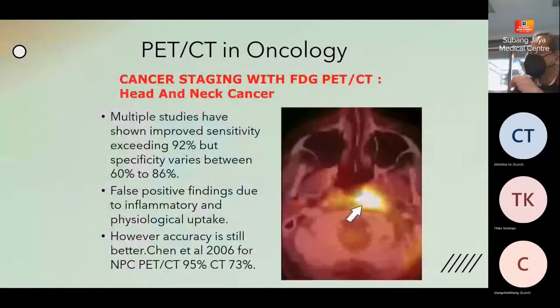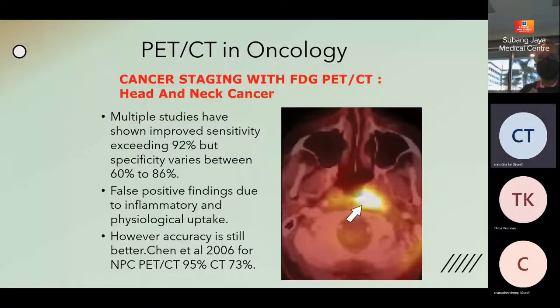FDG PET scan, sorry. So I'm not going to say anything new. PET scan has been used quite extensively since the turn of this century. So just to recap what we have known from different types of head and neck cancers, you can show that the sensitivity of PET is significantly higher than the other types of modalities.